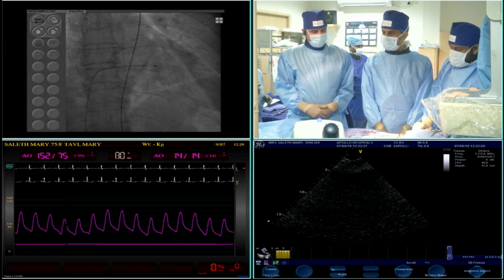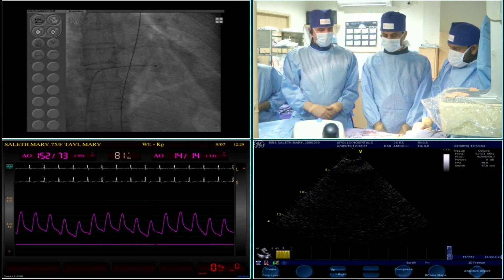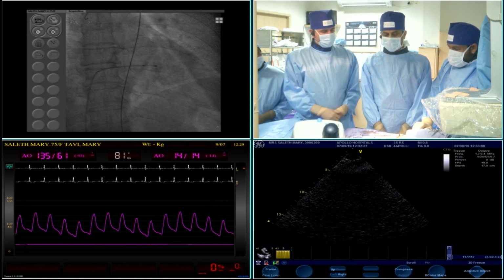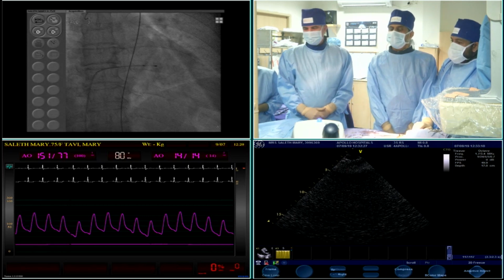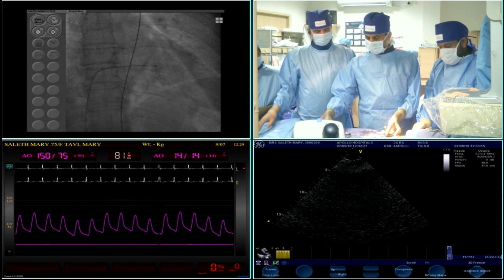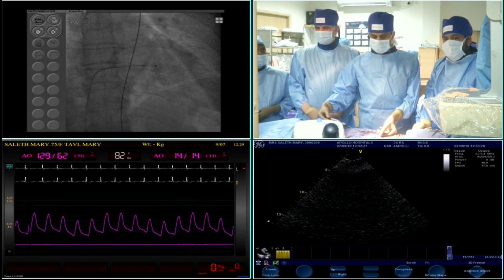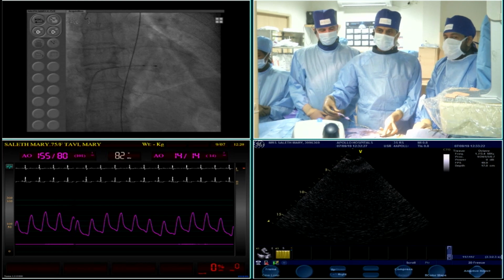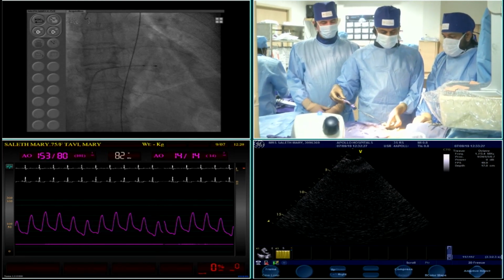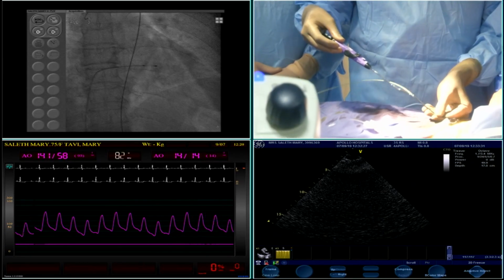So we're now ready for the ProGlide sutures, and we want to move forward because we're just achieving hemostasis with pressure at the moment. So Sengo, if you could talk us through the steps of the ProGlide deployment, please. Yeah, so we plan to have 2 ProGlides in place. We have flushed the ProGlides already over the wire. So we want to place at 10 o'clock and maybe at 11 o'clock and 1 o'clock. Maybe they can explain what we mean by 10 and 11 o'clock.